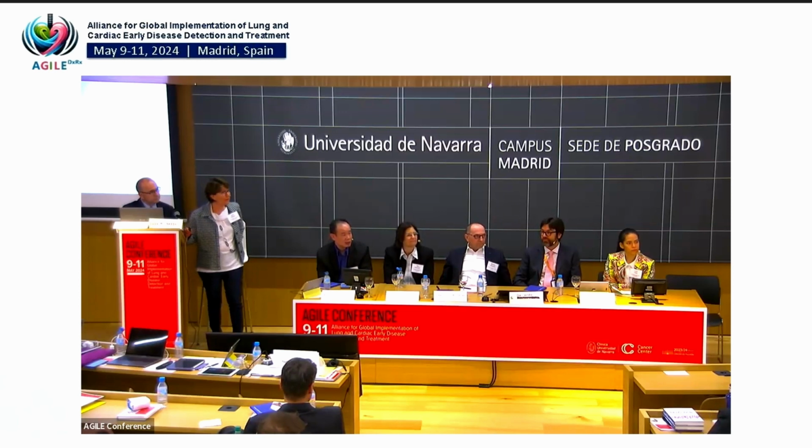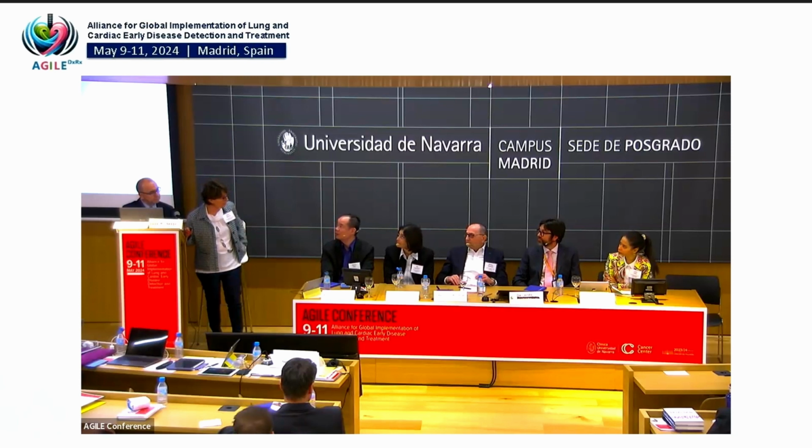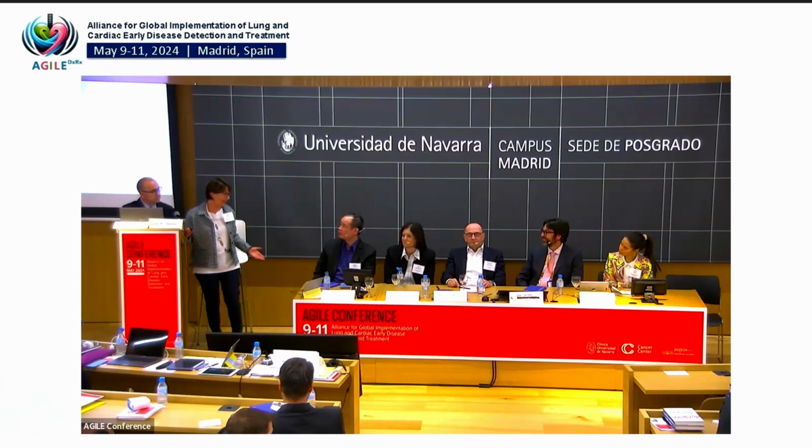Okay, so I think we had this discussion 2 meetings ago, right? Because in Lung-RADS, there is an option: biopsy, PET-CT, versus this and that and the other. And I think we were all of the opinion that PET-CT is not very helpful, but I don't think we have a nuclear medicine physician here with us to defend another opinion.